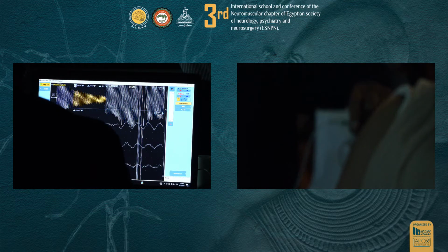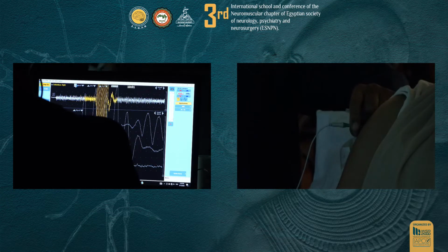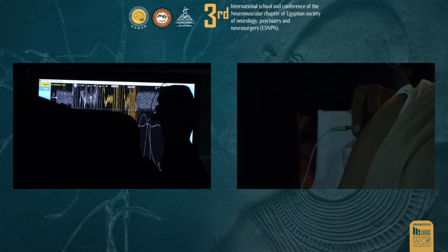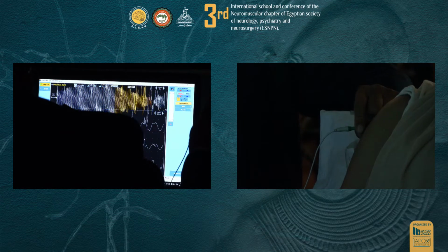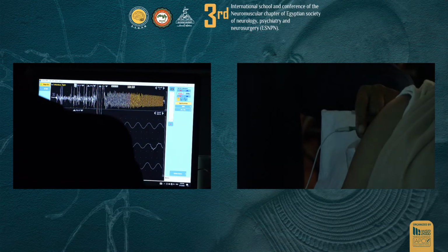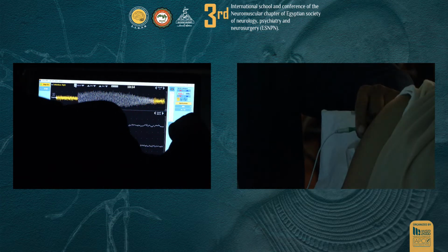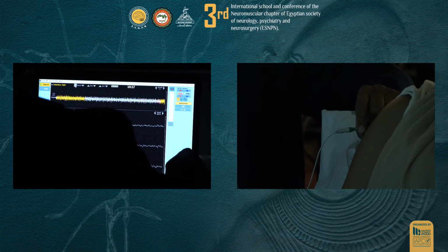You can try, put it on. You can use 2 grounds, or you want to try another ground? Sure. But I don't think it's a ground problem though. It didn't change with changing the ground. So we can try another ground, but show me. Something with the amplifier.